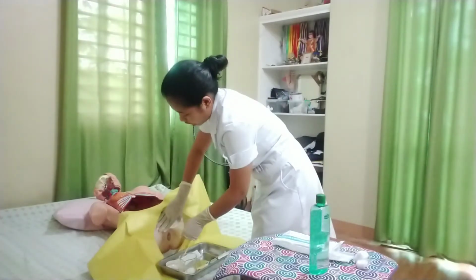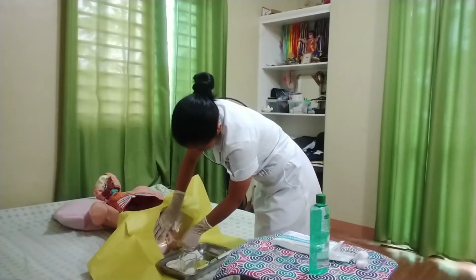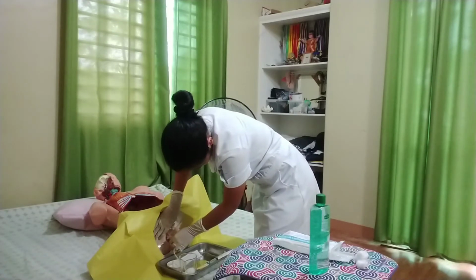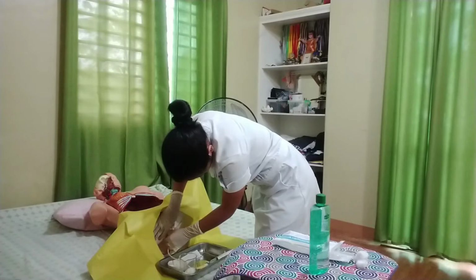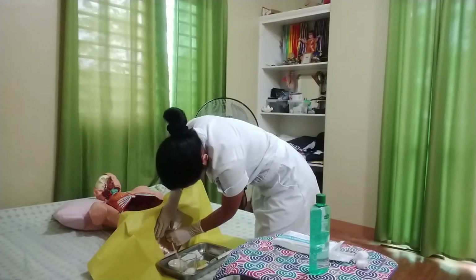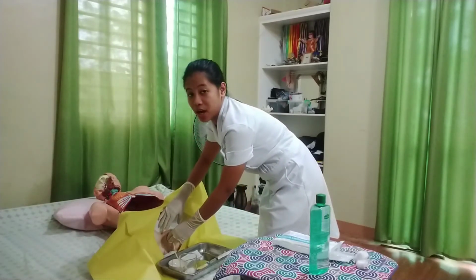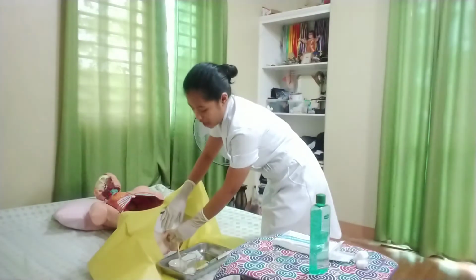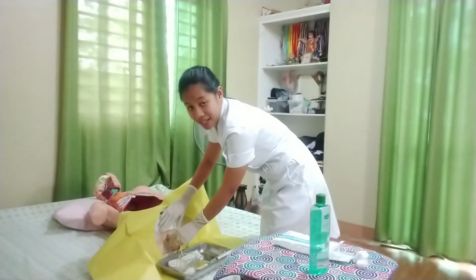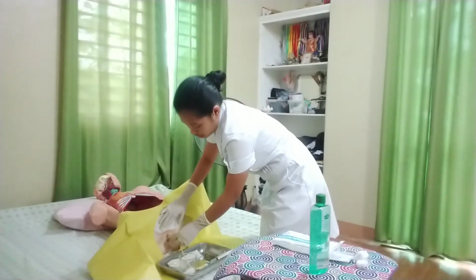So, ma'am, I want you to take a deep breath. I will now be inserting the catheter. Okay, ma'am, 1, 2, 3. So we will insert it until we can see urine flow, and if there is already urine drainage, we will advance again about 1 to 2 inches since we are using an indwelling catheter.